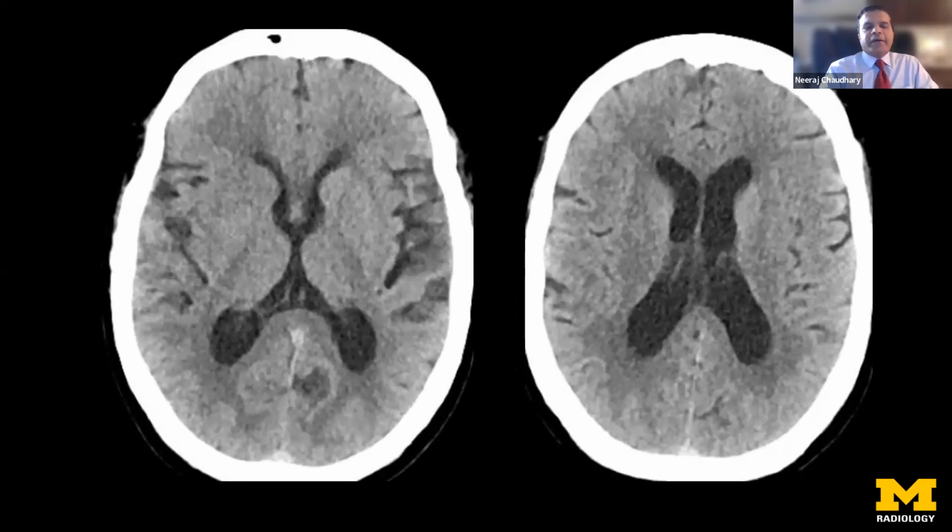Can we assess on a non-contrast CT head, is there damage? Which side is affected? You may not get the hyperdense sign in all patients, but if the clinical suspicion is high, on imaging, one has to look very judiciously. And here you can see on this image, on the right-hand side of the image, there is the caudate head bilaterally at the level of the lateral ventricles. And here on the left side, it is slightly lower in the ganglionic segment where the basal ganglia is located, where I'm pointing with the arrows.